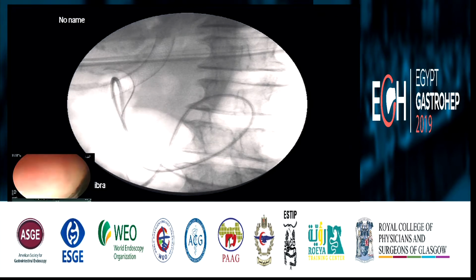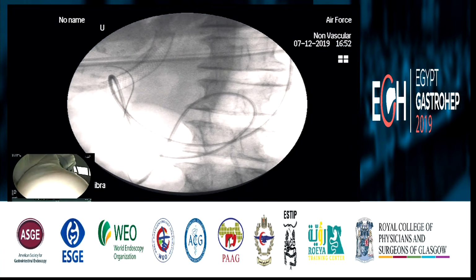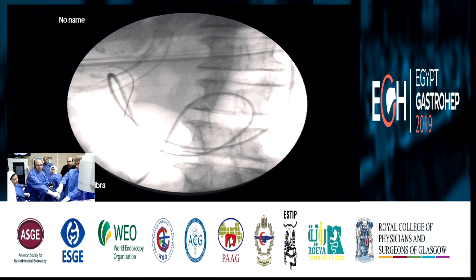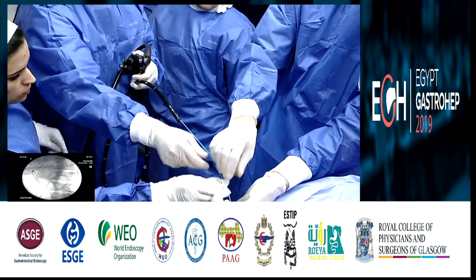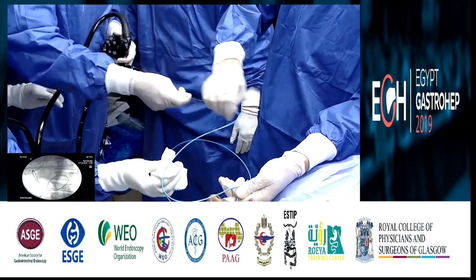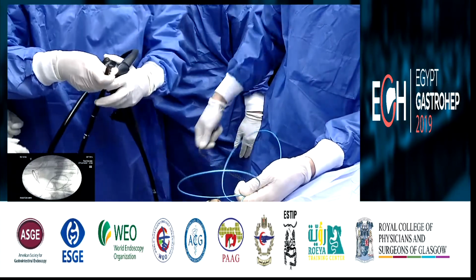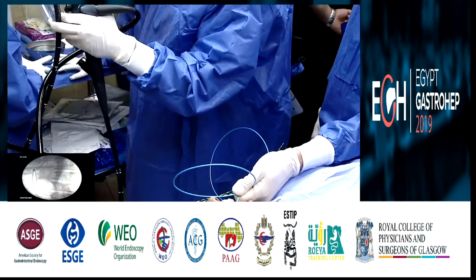Okay, so sorry, hold on, Daniel. Yes. Wait. I have it. Yeah, we need to remove this. Can you show my hands? We need to remove this. Watch out. You know, the nasobiliary, fluoro please. Professor, Manuel, what is the aim of this nasobiliary catheter, please? You see, the catheter is called nasobiliary. It's a wrong name. It's orojejunal, oroduodenal, because it's coming through the patient's mouth. And that is a very important question. Why do we need a catheter beyond the luminal stricture before placing a stent? Hold on one second. We need to remove this, and now we need the EUS linear scope.